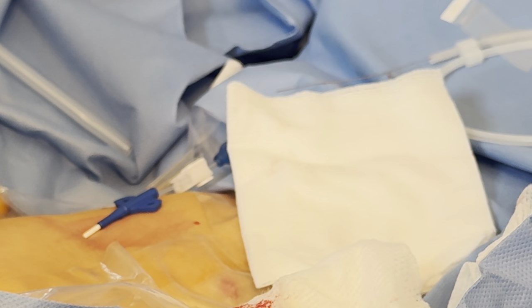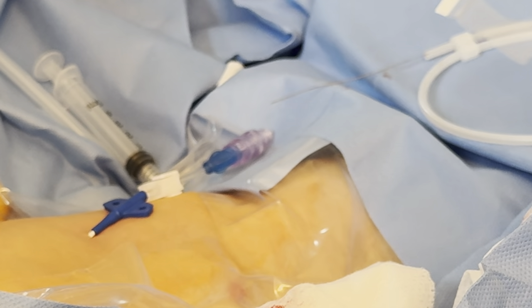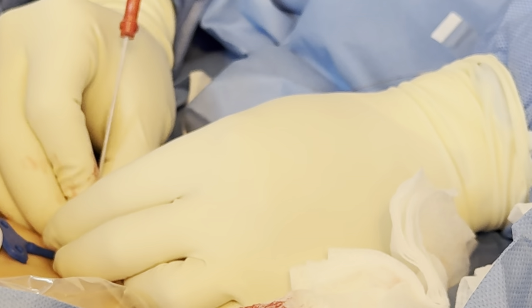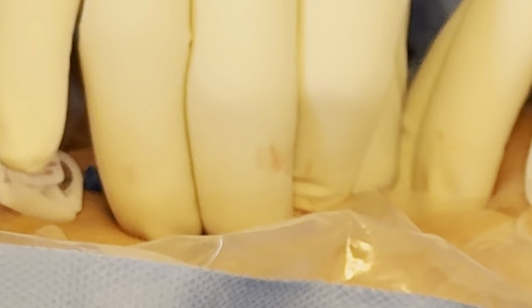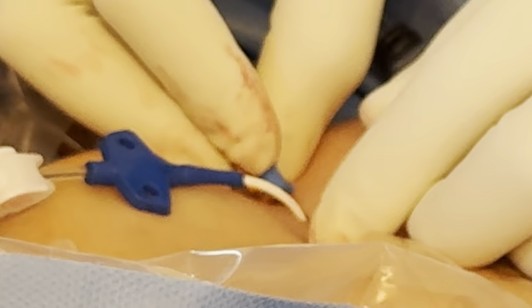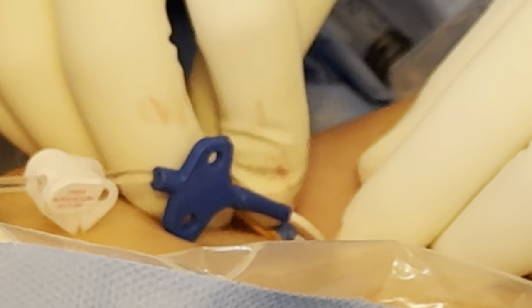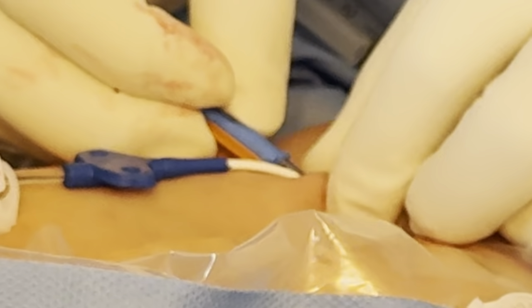Some people are worried about tearing the skin apart that way — I'm a hundred and ten percent sure that's not going to happen. The skin is extremely thick horizontally. I had a little bit of an issue with the dilation — the skin's a little tough — so I'm going to use this as a crowbar to open up a larger hole for the SecuraCath. Any pain? Nothing. I'm going to give it a little stretch. Now, with these hydrophilic catheters, there are no studies on cyanoacrylate glue. I know that's the craze right now and it has some utility, but I don't think there are any studies on whether it's going to cause these hydrophilic catheters to break down. Until that's done, I highly recommend not using cyanoacrylate glue on hydrophilic catheters.